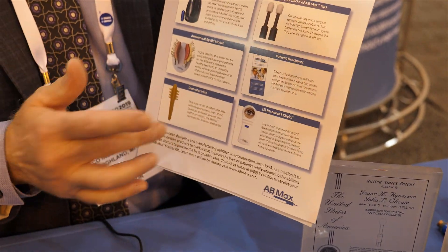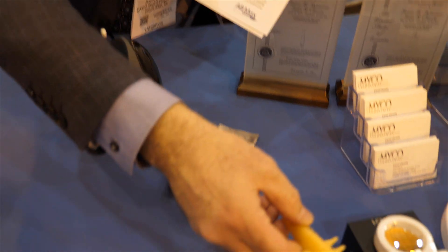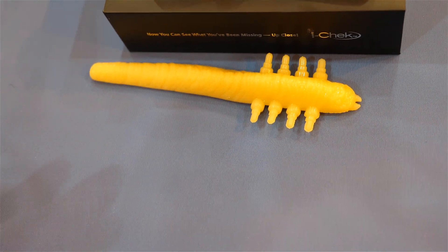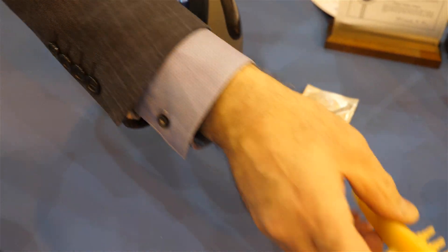The starter kit also includes five Eye Checks and a Demodex mite model for demonstrating the nasty things that Demodex do on your eyelids. It's good for educating patients on what a Demodex looks like, and hopefully that will scare them into cleaning their own eyelids.